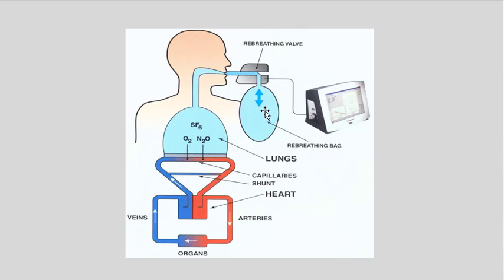So your rebreathing gases pass in and out of this bag during the rebreathing period, and the normal circuit of blood flow continues as usual, except that you now have two gases: nitrous oxide, which is the absorbed gas that's cleared continuously, and the non-absorbable inert component, sulfur hexafluoride. Interesting choice. And that's all it is. Flick a button, off you go, and you get your cardiac output.